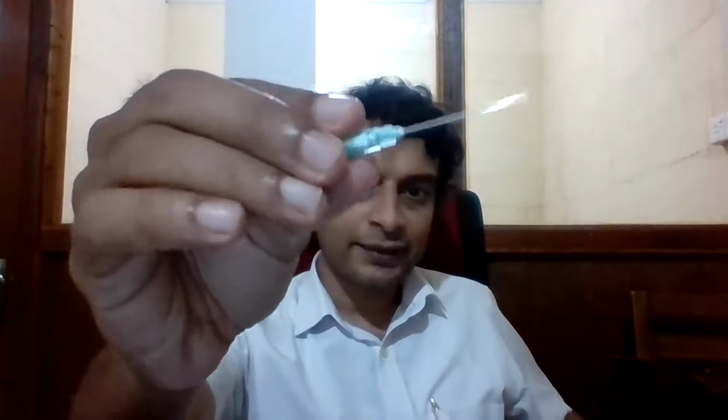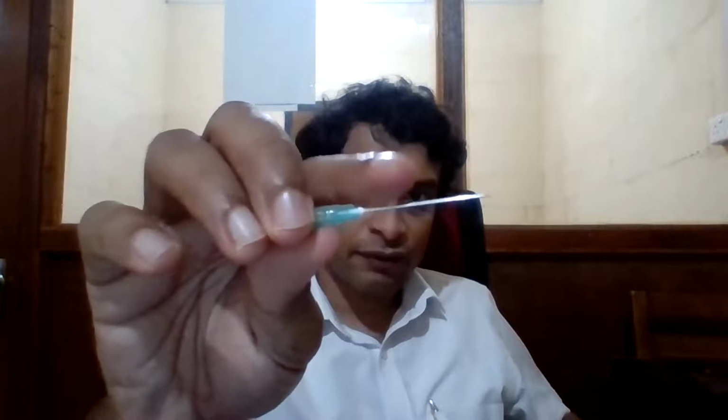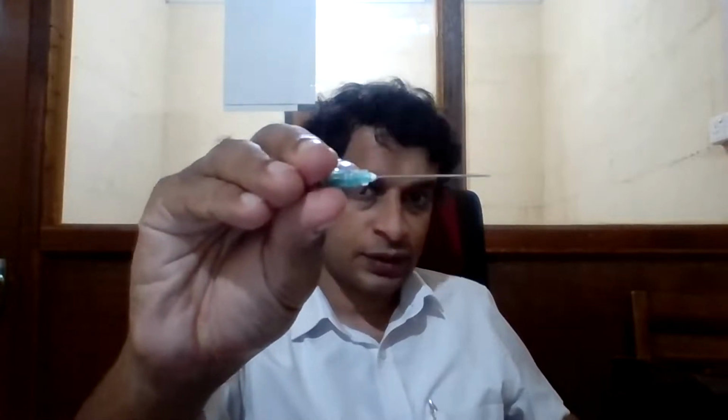And in this hypodermic needle, you will find that this one has a green tip, but there will be various other needle sizes. The size of the needle will be color coded according to the color over here. And when the diameter of the needle becomes larger, its gauge becomes smaller. So a large gauge needle is a narrow one. A small gauge needle is a wide one.